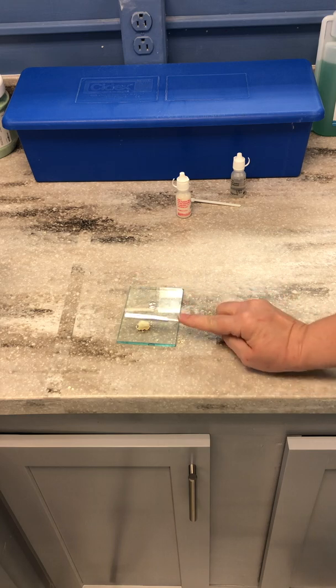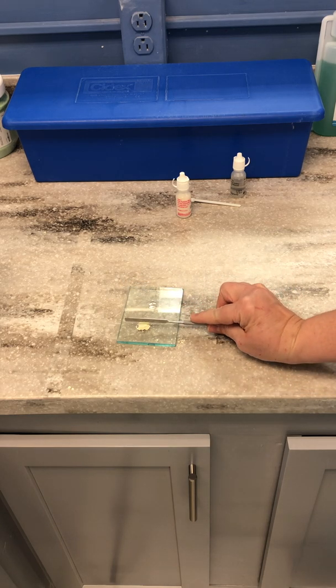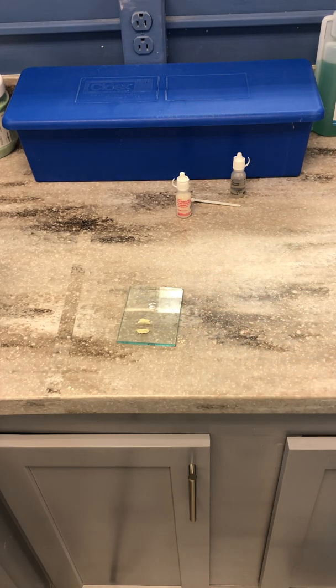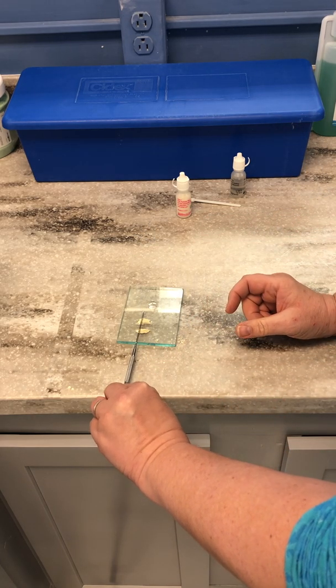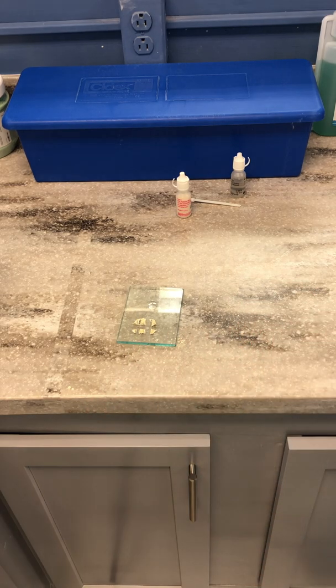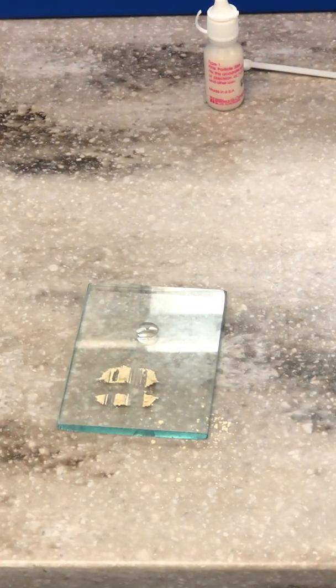Do not pat down the cement — simply make a cut in half, and then we're going to cut it again, cut it again. Now I'm going to zoom in a little bit so you can see me mixing it.